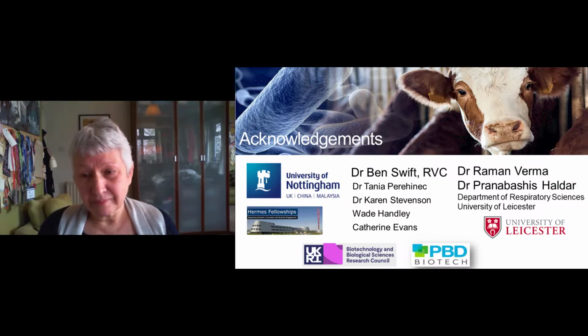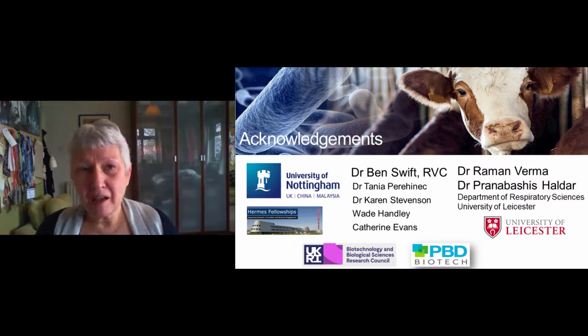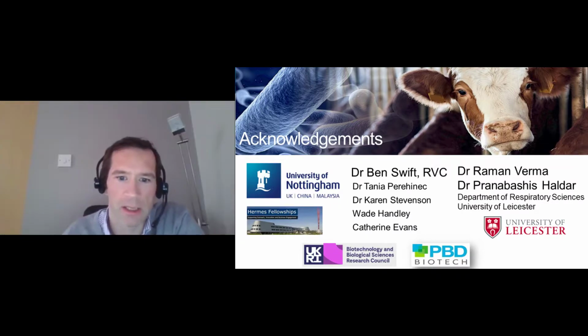Another one is, I think you have covered this a bit, but can this method be used to test for mycobacteria in other types of samples? Yes, we are working on it. Because the viruses are phage particles, which are protein shells, they are sensitive to inhibitors binding to them and also to inactivation by things like proteases. So there's a lot of sample prep work we're doing to work on different samples. But yes, we have done a range of different samples. Fluid is usually best.